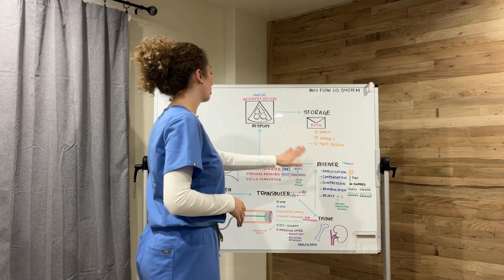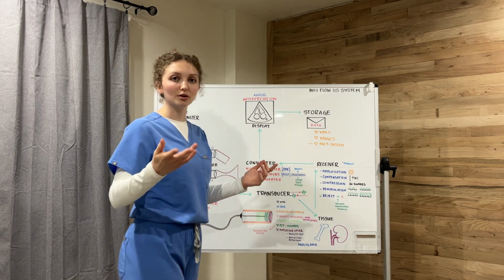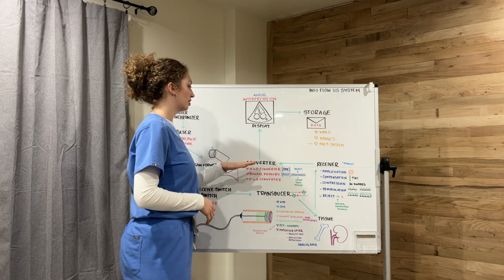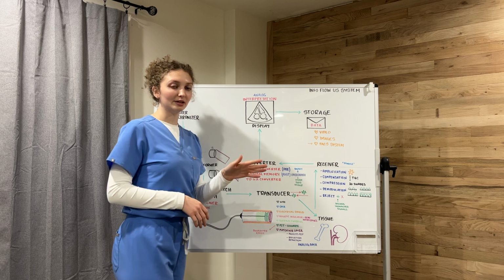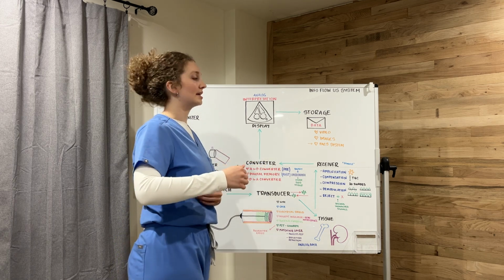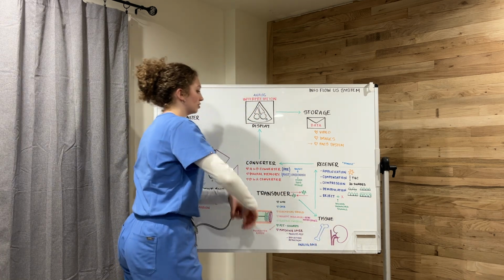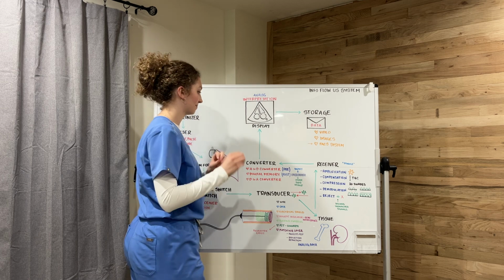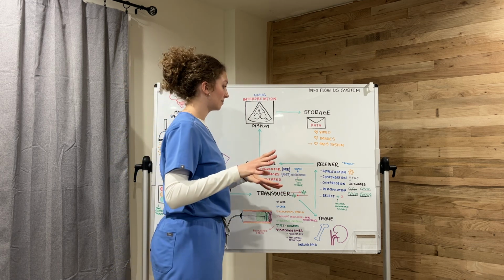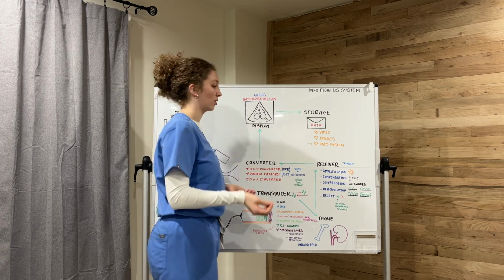From the receiver, we have the converter, which deals with analog or digital or computer data, and has a few components. Pre-processing, we have the analog to digital converter or A to D converter. This is pre-processing in the sense that it deals with the real life data and it transforms it into digital or computer data. From there, we have digital memory, which stores that data in a binary number, which is made up of a whole bunch of zeros and ones.